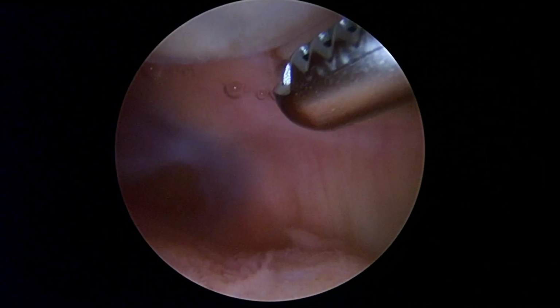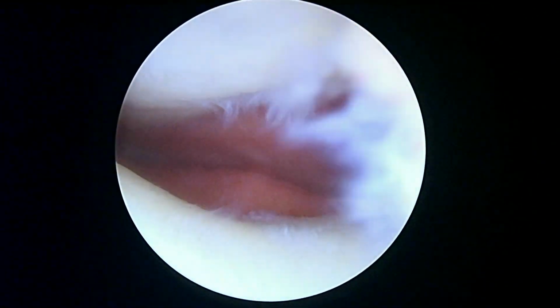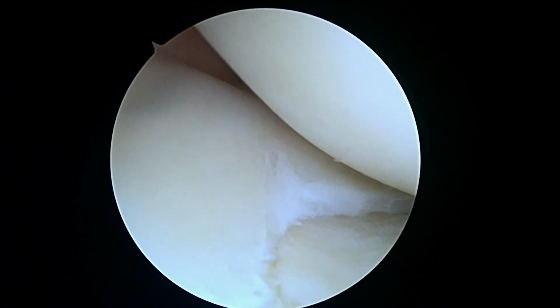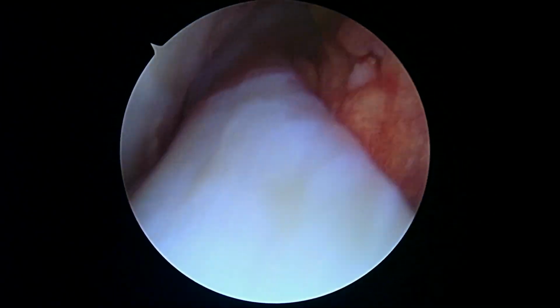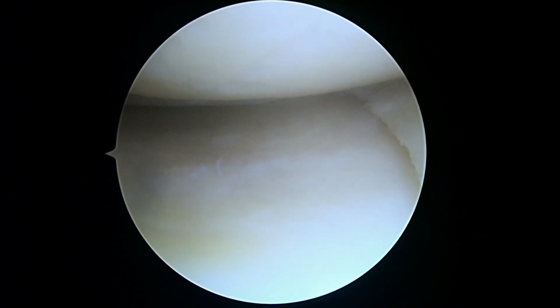We're going to go back and I'll show you the lateral compartment here if I can do that easily for you. So you can see the lateral compartment now looks pretty good. It's the tibial plateau that has a little bit of fraying on it. Okay, and so I think we're done. We luckily, fortunately, didn't have to do a meniscus repair. And now we'll go ahead and drain the knee and at the very end do our PRP injection.